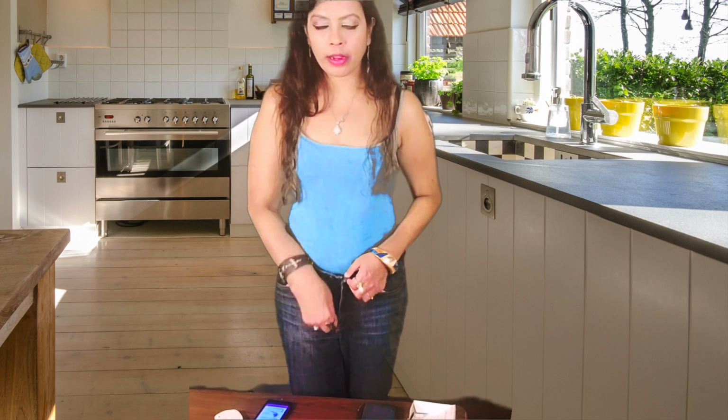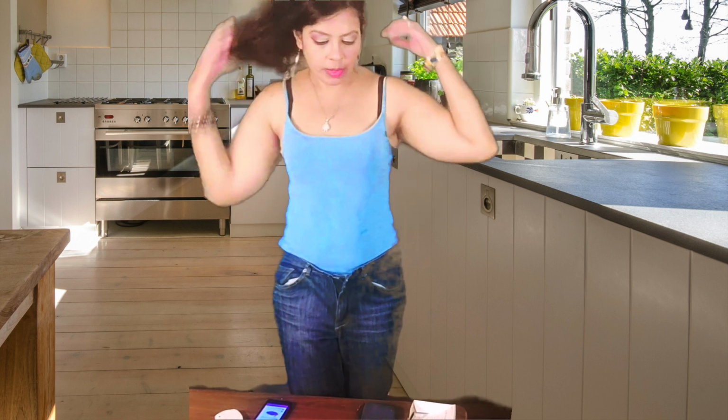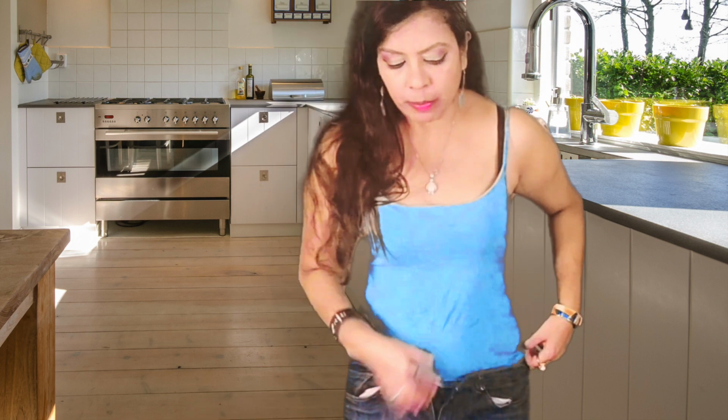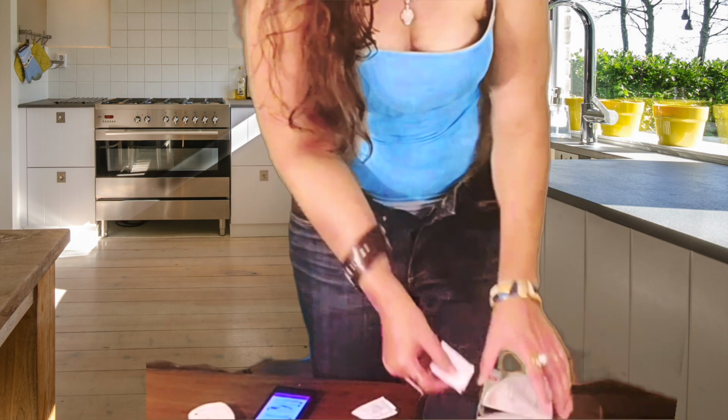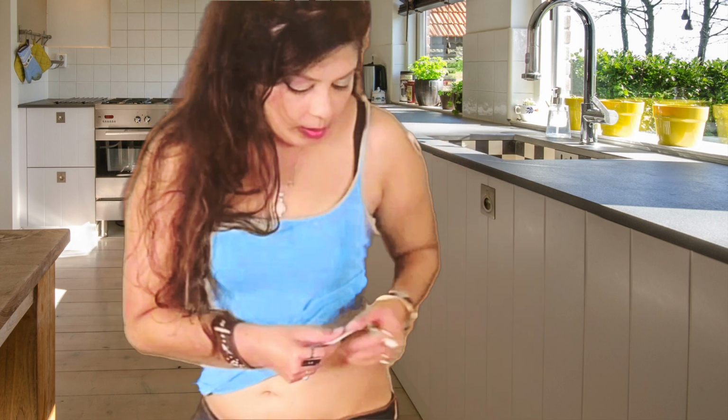Now the pod is primed and ready to be worn. So I'm going to be applying it, and I will be wearing it on my side, I think. So this is the side that I'm going to pick. So I have my alcohol wipes here. You don't have to apply the wipe over a large swath of skin, but just on the area where you're going to be wearing the pod, okay? So this is what I'm going to do.